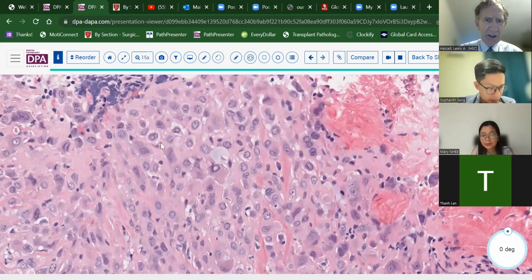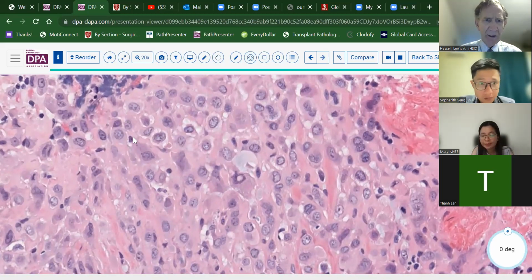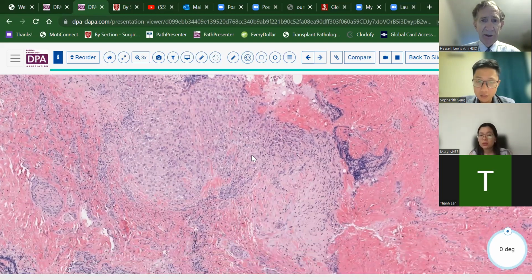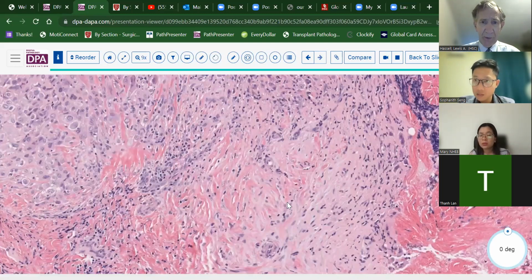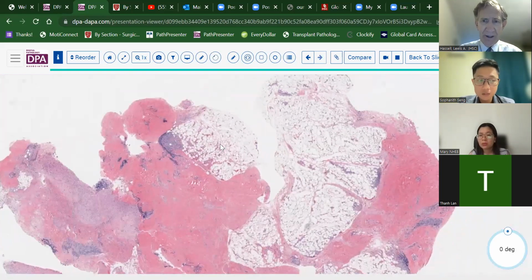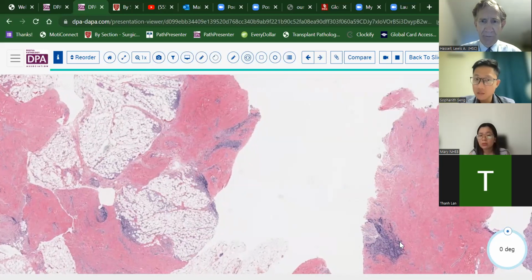But really, as you look at these, there's certain nuclear pseudo-inclusions, irregular nuclear membranes. This looks much more atypical than any histiocytic lesion should look. Now, we might think about things like melanoma, because sometimes melanomas can have an epithelioid appearance and get pseudo-inclusions. This lesion would stain negatively with S100, but it would stain positively with cytokeratin, which sometimes is a confusing feature for many people.